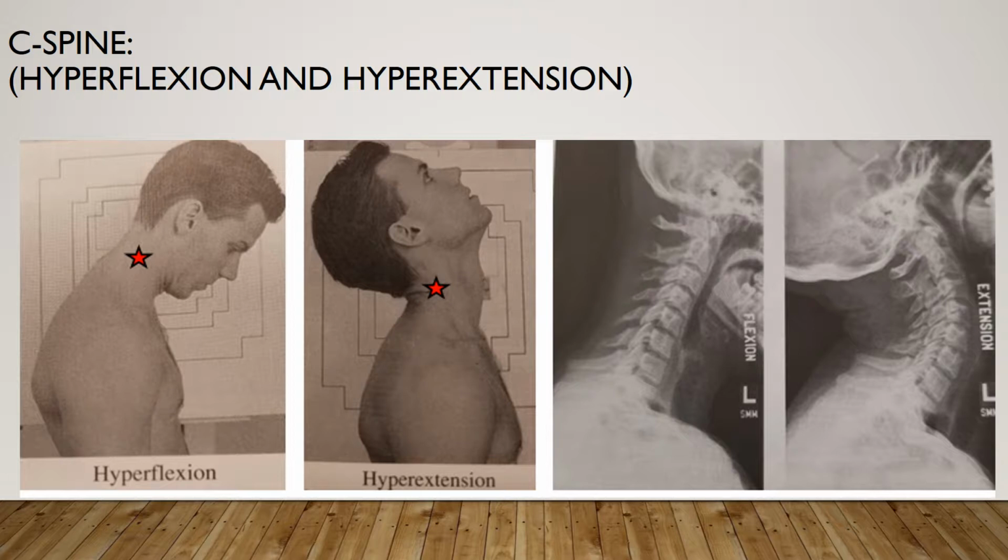For trauma patients, do not remove the cervical collar and do not move the head or neck until authorized by a physician who has evaluated the horizontal beam lateral image or the CT scan of the cervical spine. When you're looking at the images, you want to have C1 through C7, and what you're going to show is a range of motion and ligament stability.